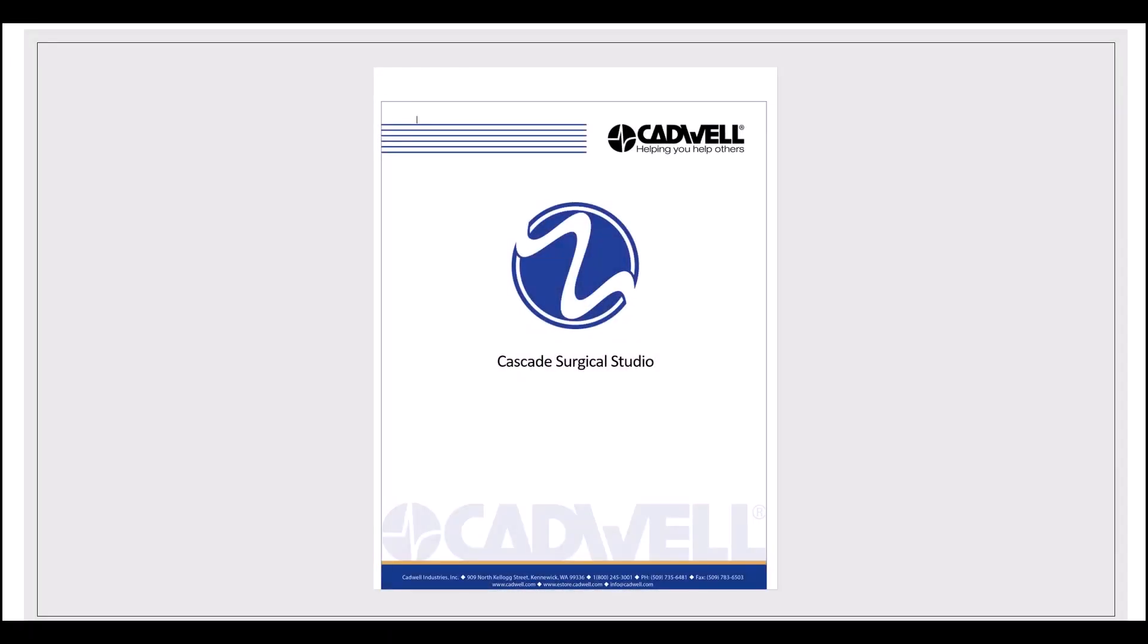The CADWELL Cascade Surgical Studio CAD-X Simulator allows the user to simulate changes in electrode impedances and the subsequent changes that are visualized in the recording.